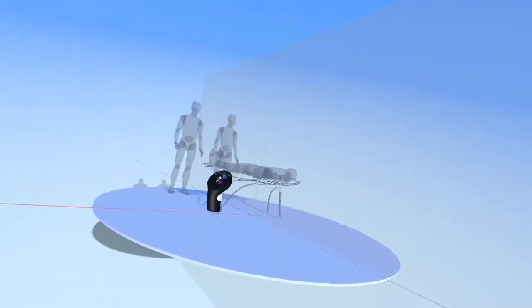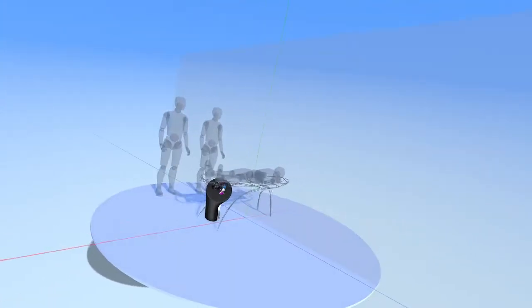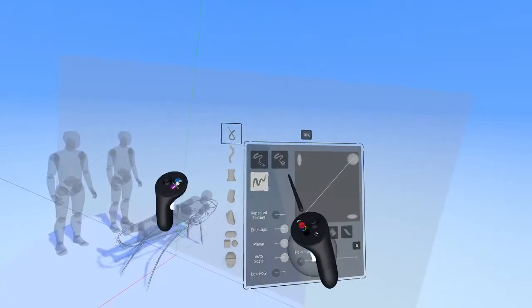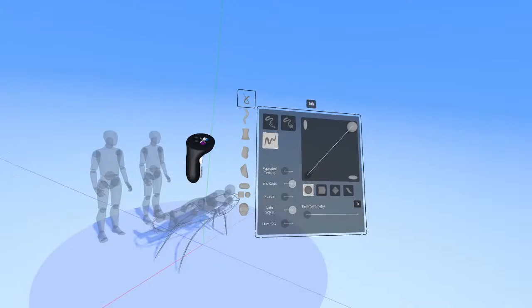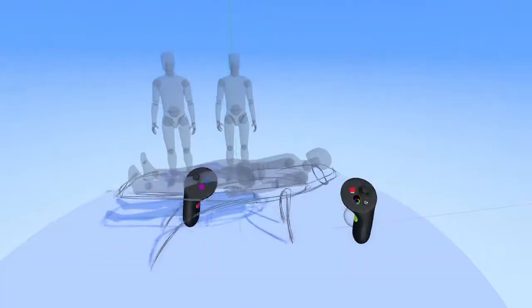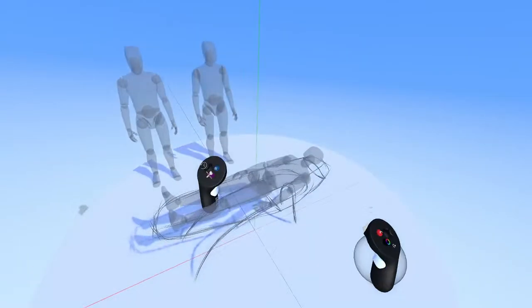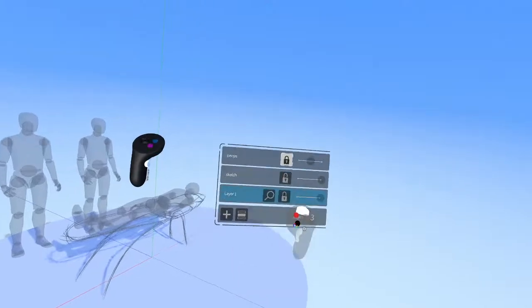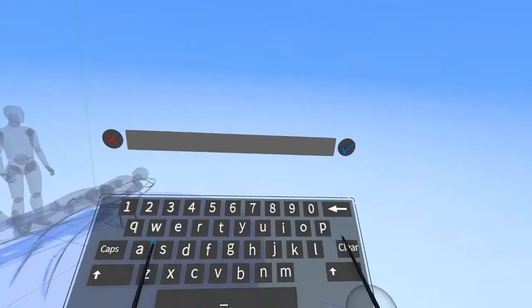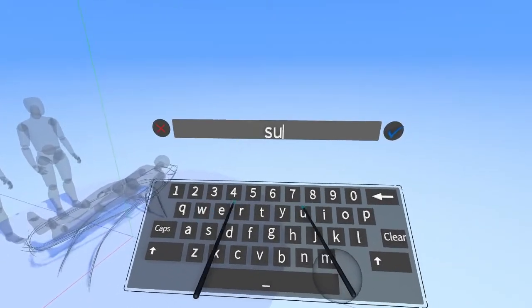All right. So that's a good enough sketch for what we're going to build on this table. We're going to keep it simple. And I'm going to go back here to the ink tool, turn off planar, and yeah, now we have our raw sketch. And so let's start building this out with different types of geometry. What I'm going to do now is create a new layer here. Let's name this just surface.